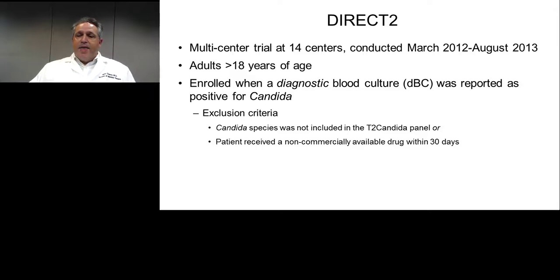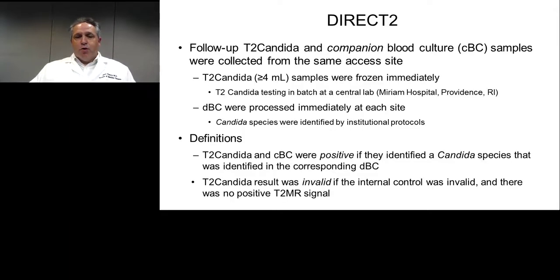And then at that point, patients were enrolled, and 2 to 3 days later, after the diagnostic blood culture came positive, a follow-up T2Candida and companion blood culture were drawn simultaneously from the same access site. And the blood culture was always collected immediately prior to the T2 sample from the same site.